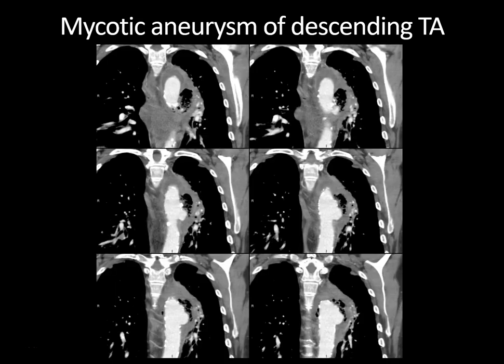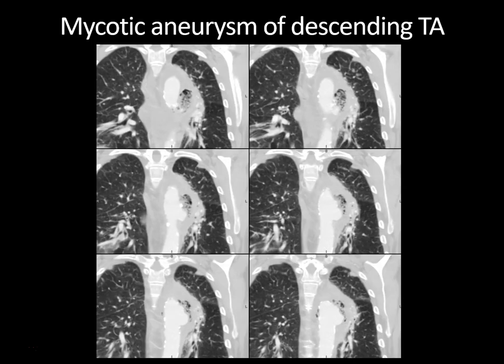Additional coronal reformatted images show the hyperenhancing rim surrounding fluid indicating aortitis, and the multilobulated irregular mycotic aneurysm surrounded by numerous foci of gas. Switching to lung windows confirms these are multiple foci of gas coalescing about the aneurysm, indicating an adjacent abscess. These carry a very high mortality and tend to be treated with endograft or surgical repair following antibiotic treatment.